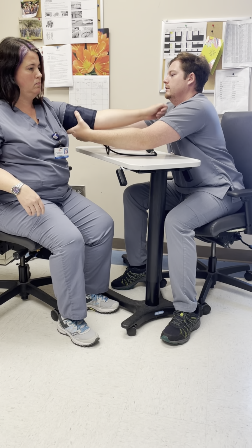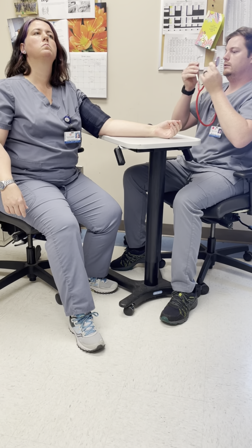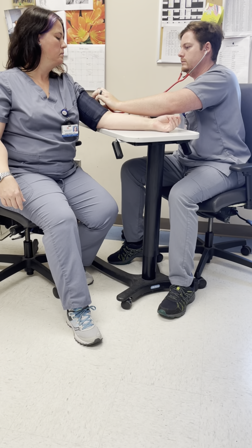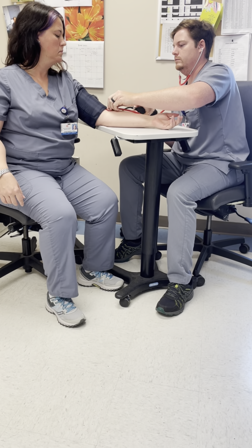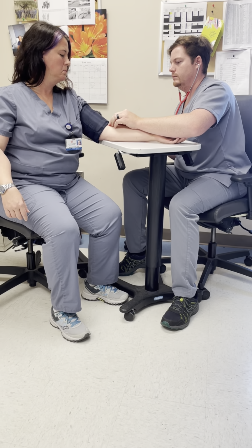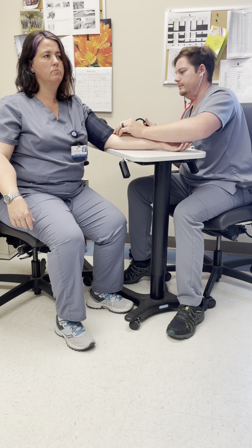And then so we got the table about heart level. So I want you to feel relaxed. This thing keeps sliding down on me. Okay, keep it about 1 inch. All right, and just relax.